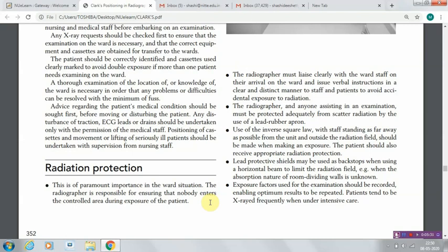If you are going to take radiography of a younger patient, it's always better to have a shield. And another main important factor is the exposure factor. So always have the exposure factor set with the accurate method, because sometimes you have to see where you fix the plug in portable radiography, in mobile radiography. Where you fix the plug, it should be properly in the higher energy plug, not in the normal plug.